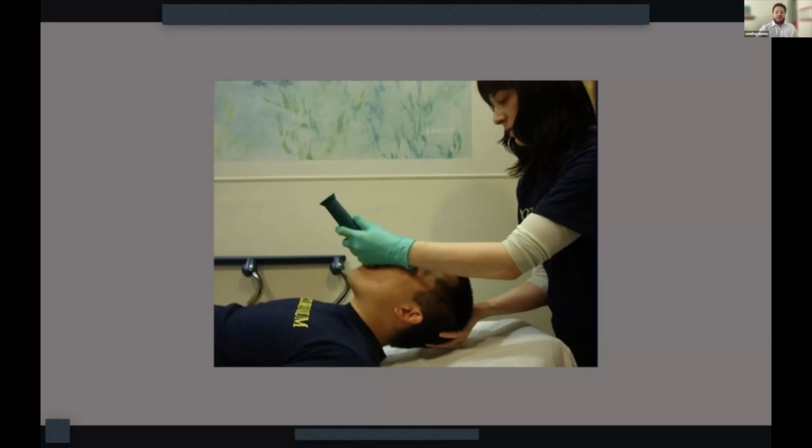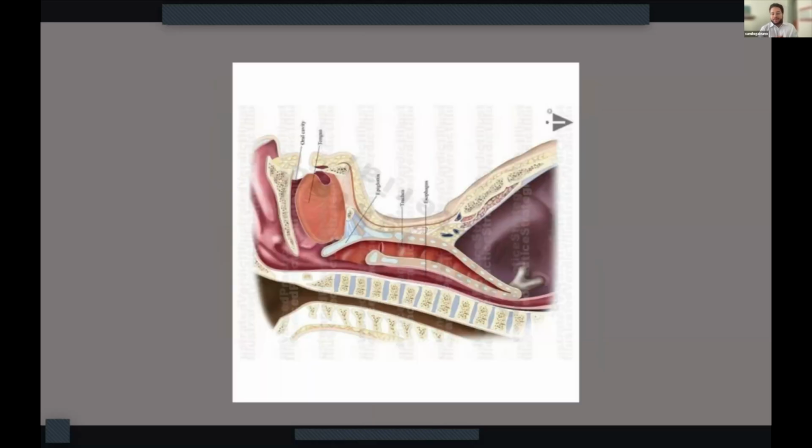After that, the other thing that is most difficult, especially with our hyperangulated blade, is the insertion of a laryngoscope. I don't know if you guys can see my crude animation, but you can see that the hyperangulated blade has a very acute angle to it. So when you're inserting the laryngoscope, what I often see is that you insert it straight into the mouth. But as you can see, it tends to get hung up in the middle of the tongue. It doesn't usually pass that.